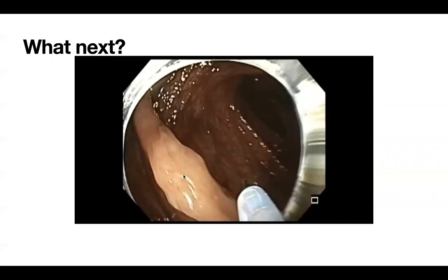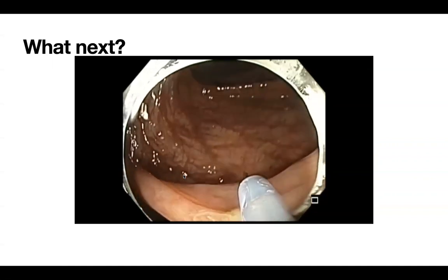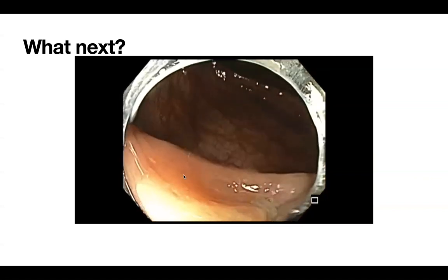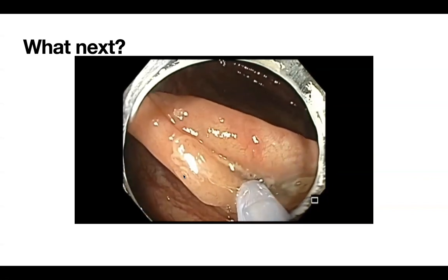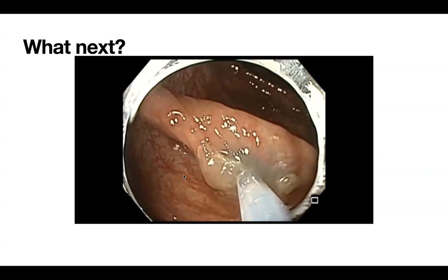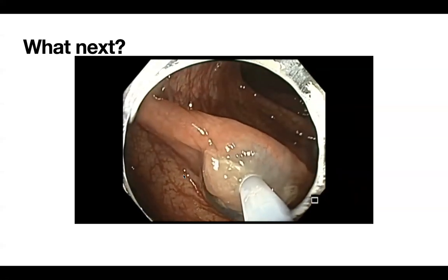So we decided to do the injection, and we used basically saline with a little bit of methylene blue. I did not add any epinephrine. As you can see here, I went forwards and then started injection on the cecal side of the polyp. You can see my endoscopy assistant is slowly injecting, tap, tap, tap.